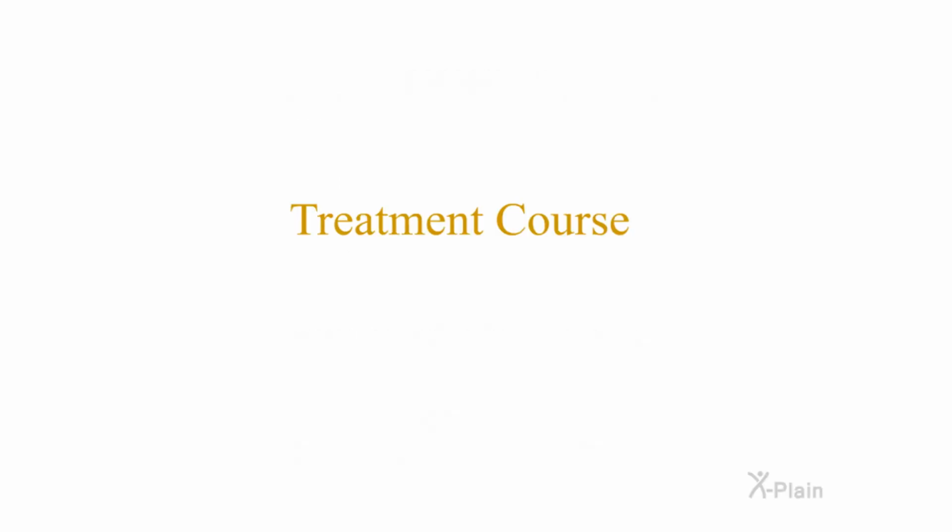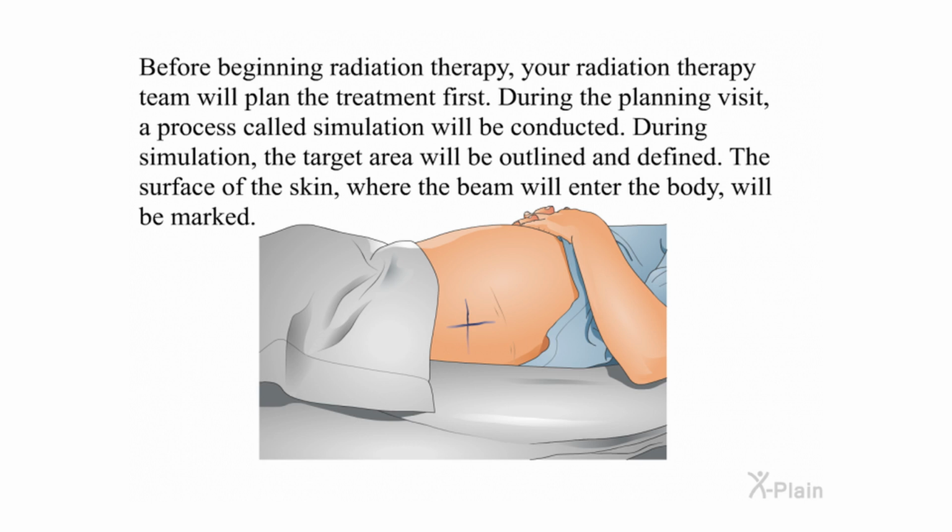Treatment course. Before beginning radiation therapy, your radiation therapy team will plan the treatment first. During the planning visit, a process called simulation will be conducted. During simulation, the target area will be outlined and defined. The surface of the skin, where the beam will enter the body, will be marked.